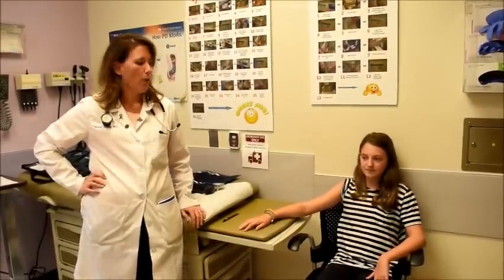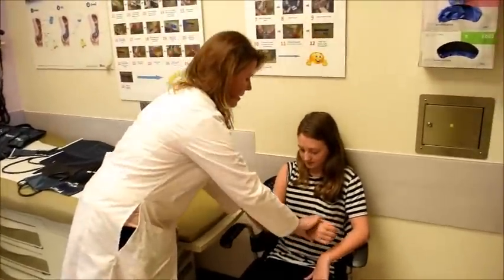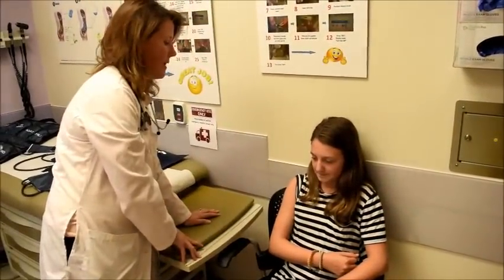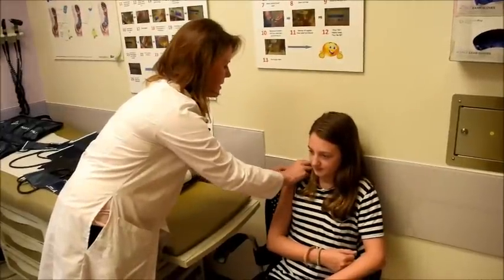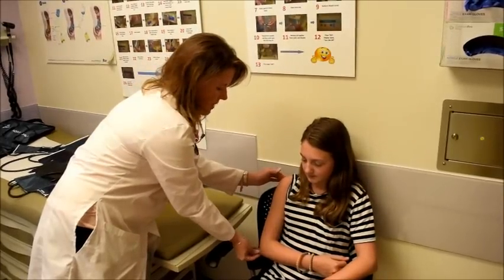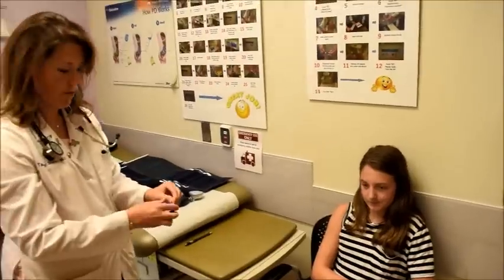The first thing you're going to want to do is measure the bicep arm circumference, because that's the essential step in choosing the right blood pressure cuff. The way in which you do this is you want to place your participant's arm in a 90 degree angle, and you want to make sure that you're able to palpate the bony prominences. What you need here is the acromion, which is the bony prominence up the shoulder, and you're going to want to measure from there to the tip of the elbow. So you'll need a tape measure to do this.